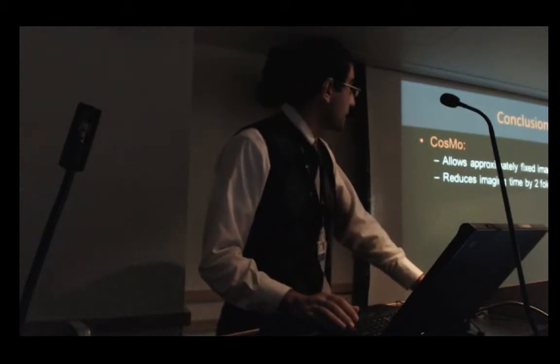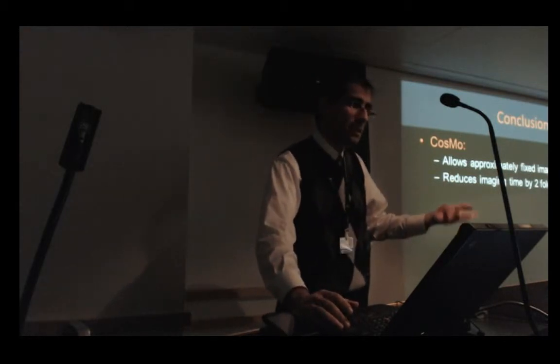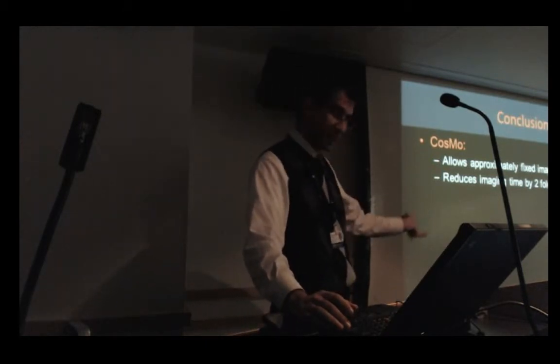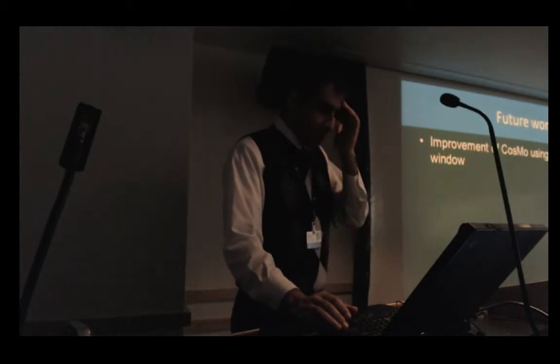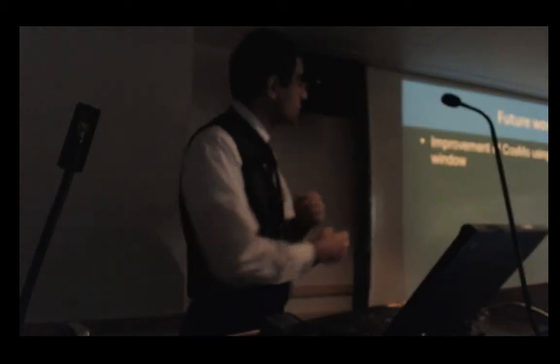Again, here you are looking at the distal region of the right coronary artery in the COSMO image when we use compressed sensing to estimate the k-space lines, and this is the motion-corrupted image. Again, you can appreciate the delineation of the distal region. So as a conclusion, we show that COSMO is a promising technique that finishes the scan in a given time. It doesn't prolong the scan time twice, and it also preserves the image quality.